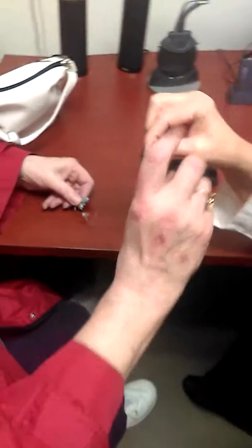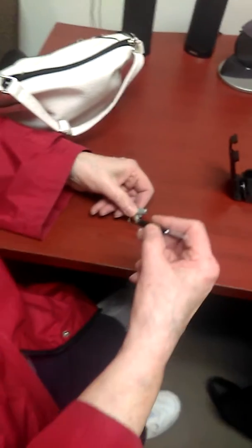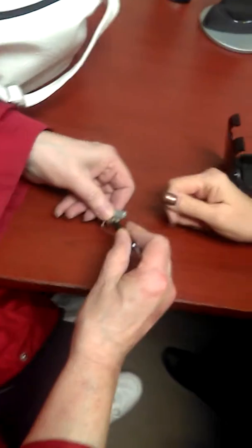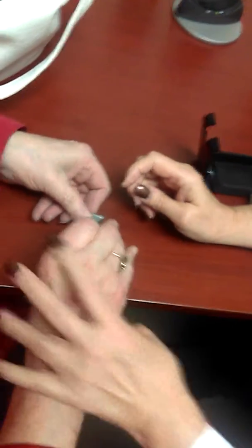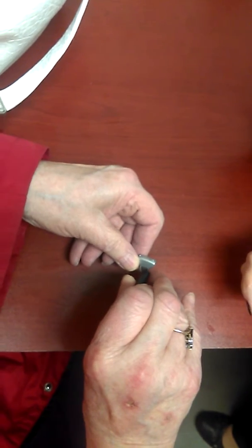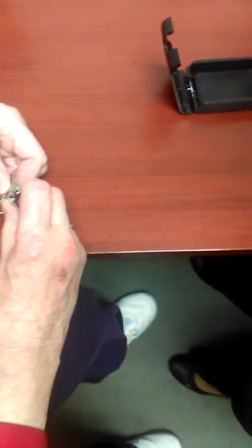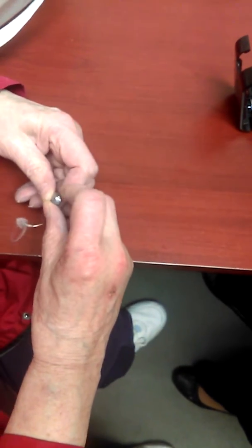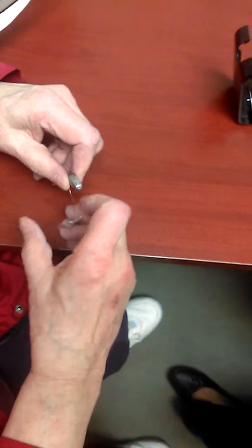I want you to take the battery in your hand. I want you to put it in there. Put it in here, just the way it is. You got it — it's right on the end. Tip it up. Straight up. Put it straight in. Slide it off. There you go. Oh, that'd be nice. And close it. Close it. Push it hard. I want to — you're not going to break it. It's okay. And if you do, I'll fix the door.